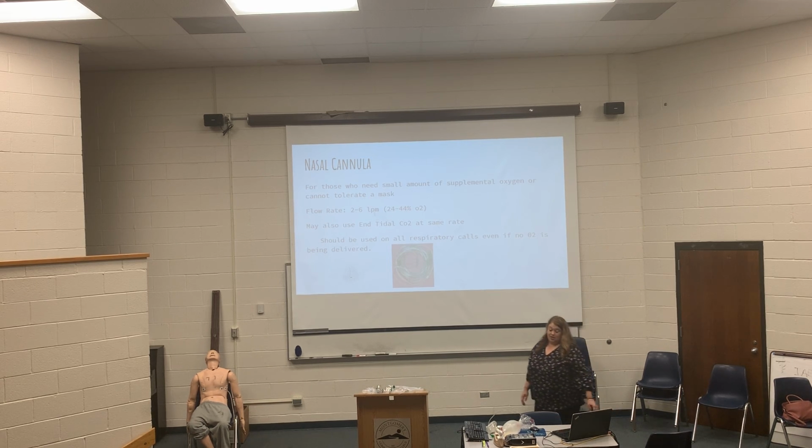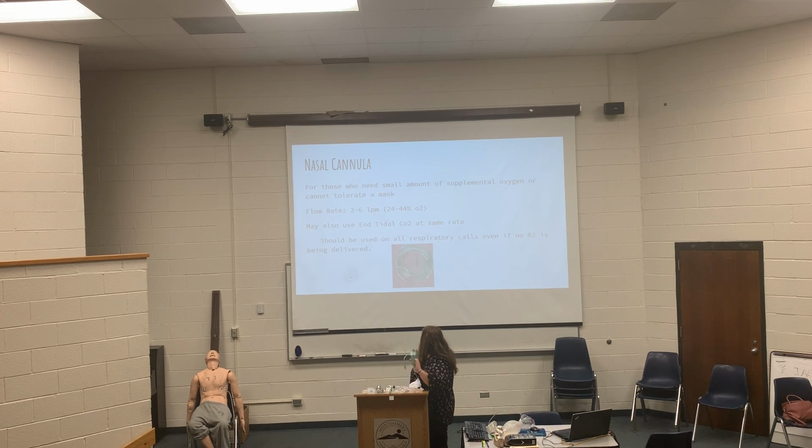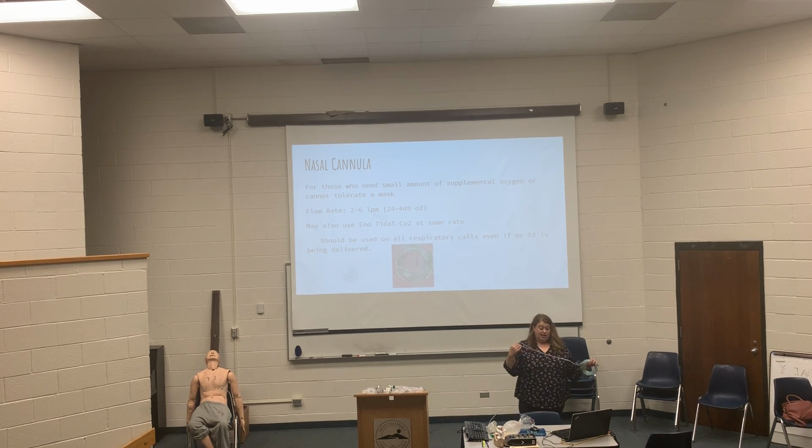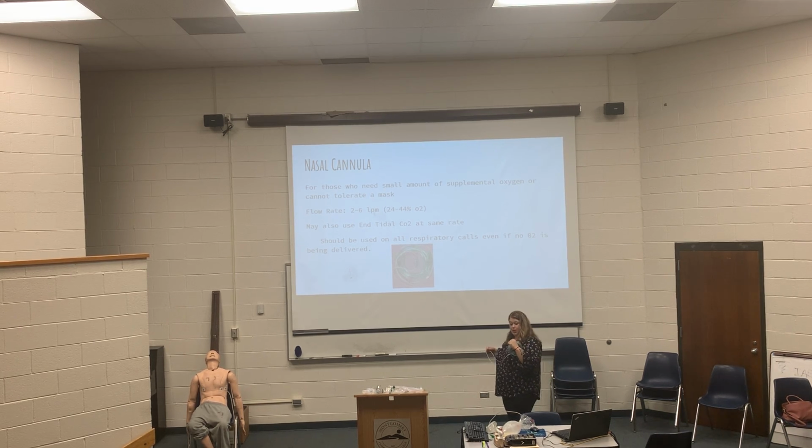So the nasal cannula, this is for those who just need a small amount of supplemental oxygen, or they can't tolerate a mask, and you will find lots of people who cannot tolerate something over their face, especially when they can't breathe. They get all panicky, and so you'll have to either blow by or you can do this. Now, you only want to do it 2 to 6. If you go to a nursing home, inevitably that patient will have an oxygen saturation of 50 and they'll have it on 2 liters, but most of their equipment doesn't really go as high as it needs to.